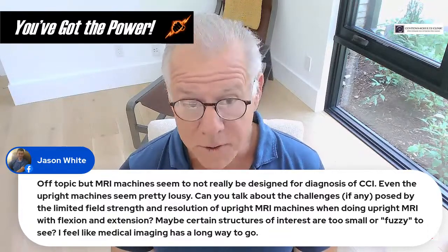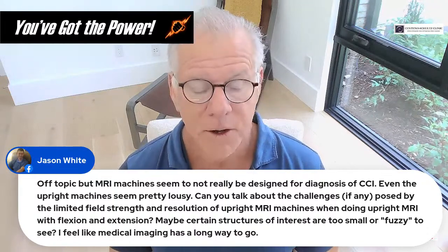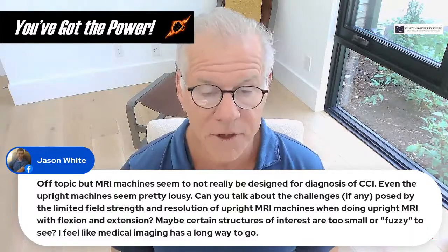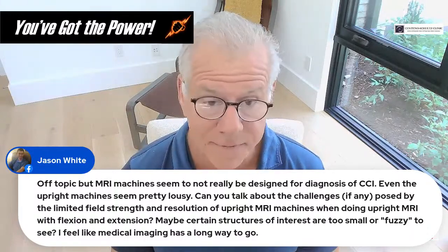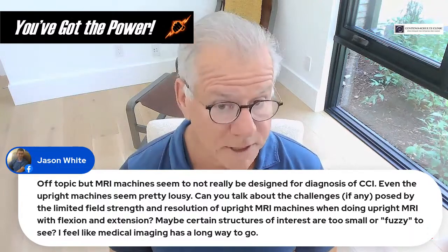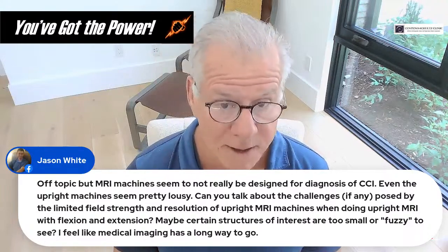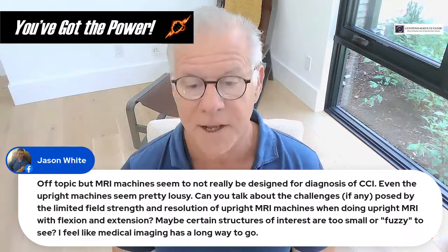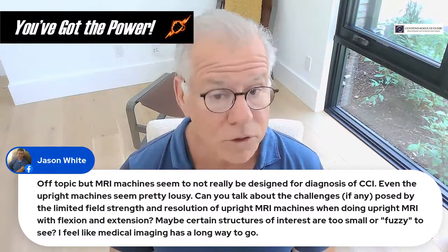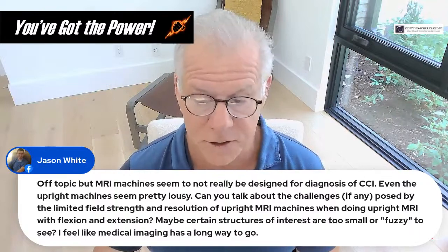So listen, what I do is I focus on the strengths of each. For movement-based MRI, upright's the way to go. You can get information off of that you can't get from a closed bore unit. But when it comes to identifying specific structures, if we really have a question about looking at a specific ligament, alar ligament, transverse ligament, PAOM, tectorial, etc., then a closed bore MRI would be better for that because it's going to give a sharper picture.